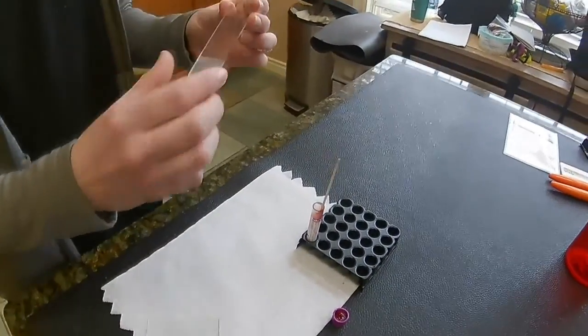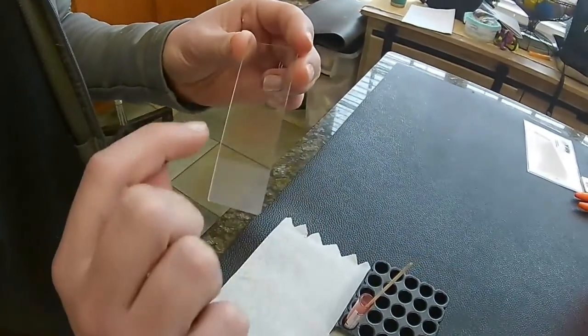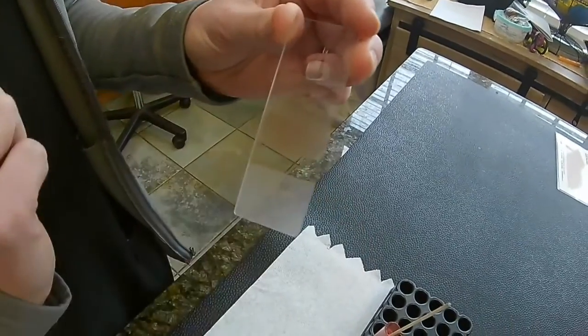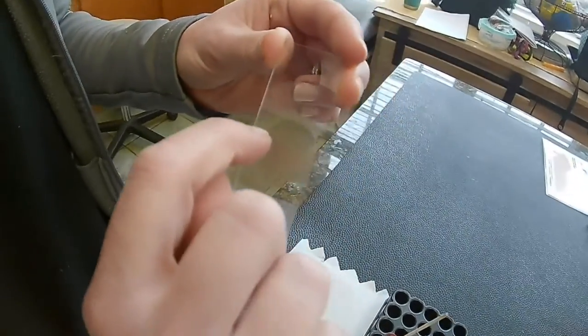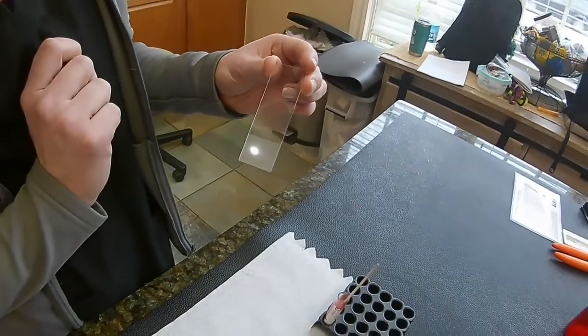So with this, what I'm ideally looking for is the feathered edge. So up here, we have that little feathering, and just behind that, right in there, is the monolayer. That will be where I'm actually looking under the microscope to do my CBC.